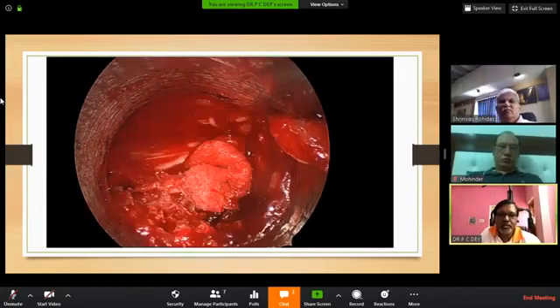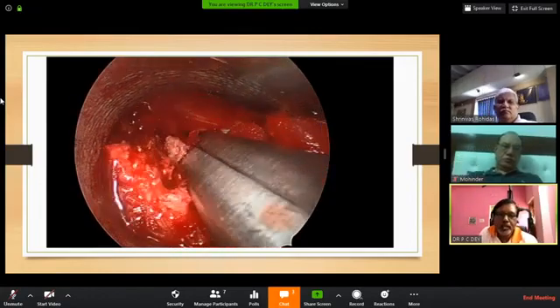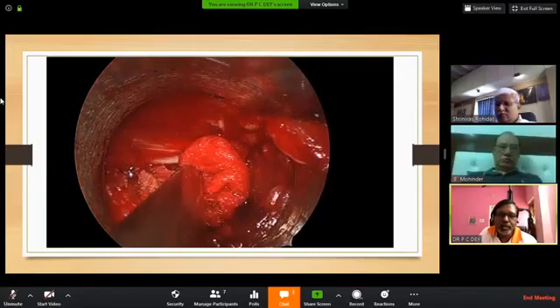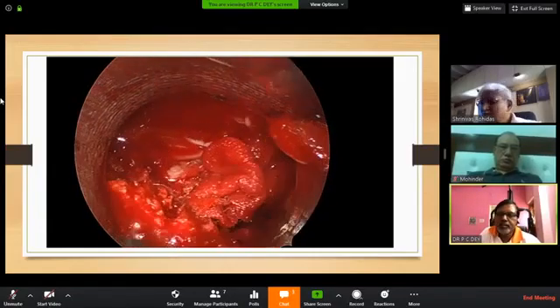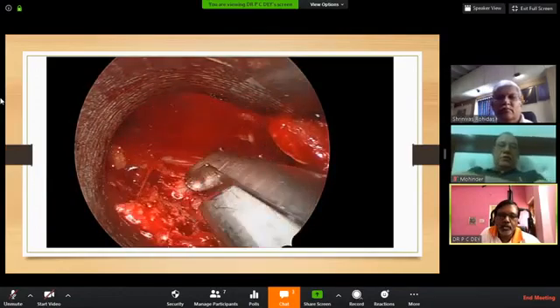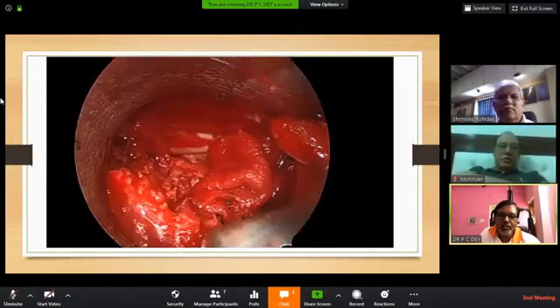Even I was discussing during the surgery with the anesthetist what is the cause of this bleeding. It's hardly 3-4% of the patients I'm facing, not always. Dr. Mohinder, please. How to control the bleeding and what is the cause of the bleeding?